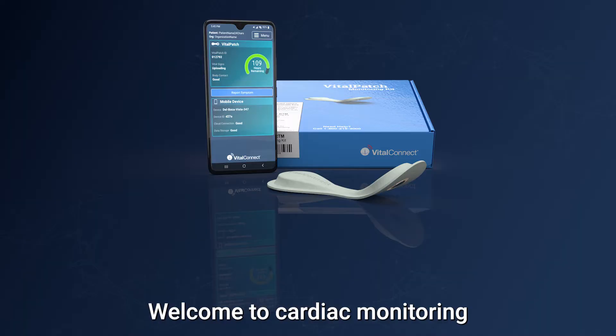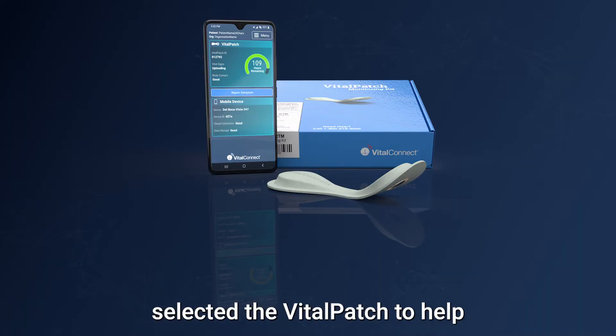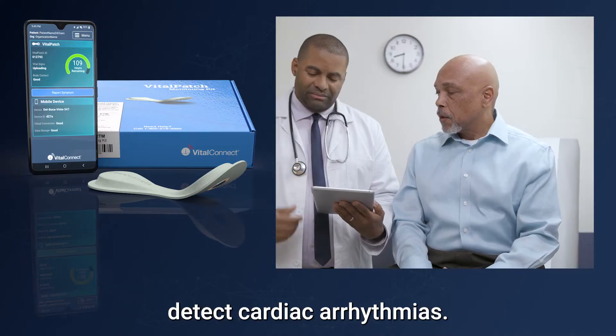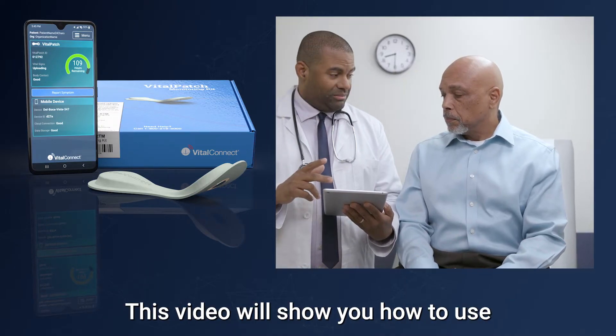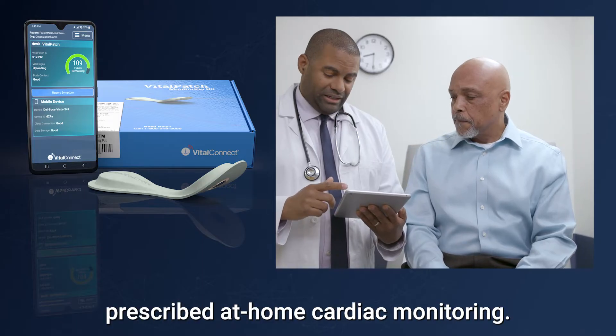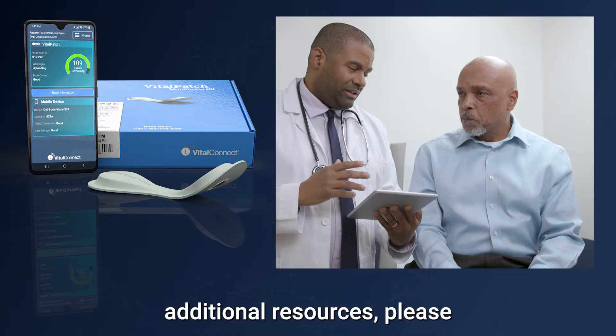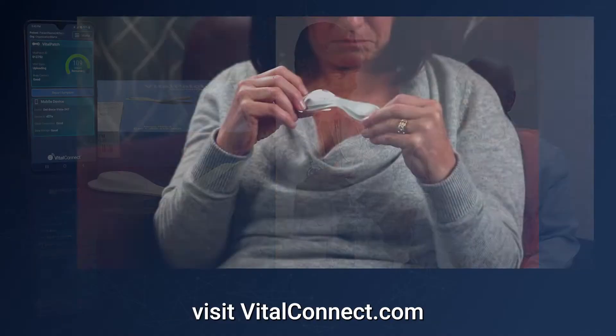Welcome to Cardiac Monitoring with the Vital Patch. Your care provider has selected the Vital Patch to help detect cardiac arrhythmias. This video will show you how to use the Vital Patch and Vistaphone for prescribed at-home cardiac monitoring. For more information and additional resources, please visit vitalconnect.com.